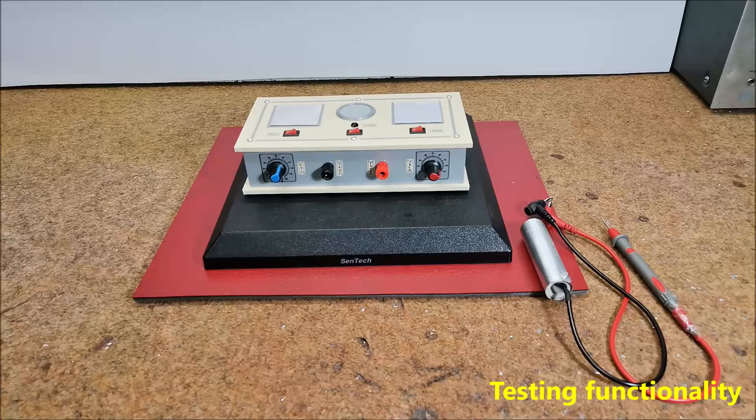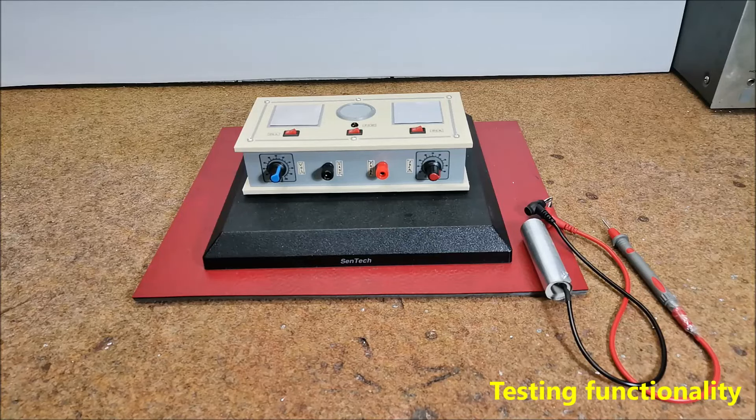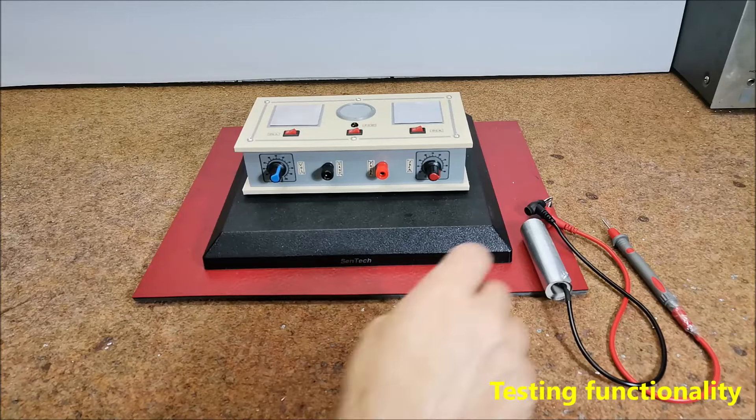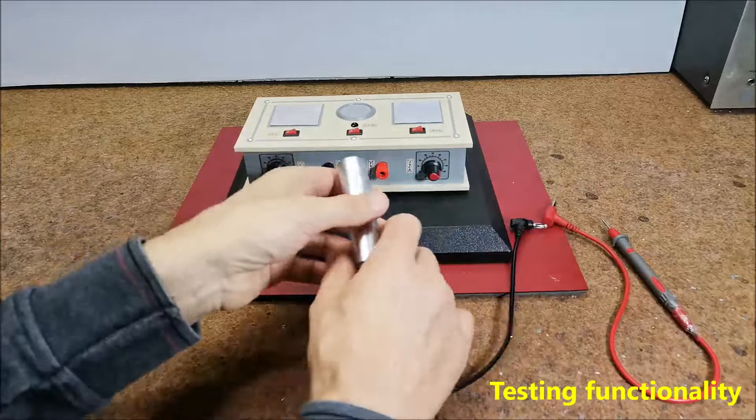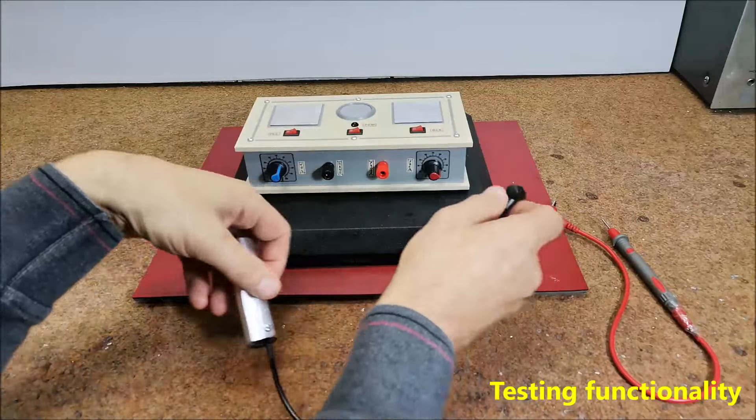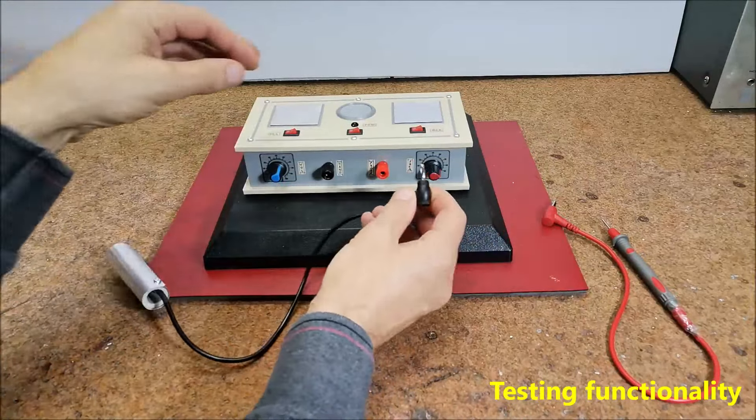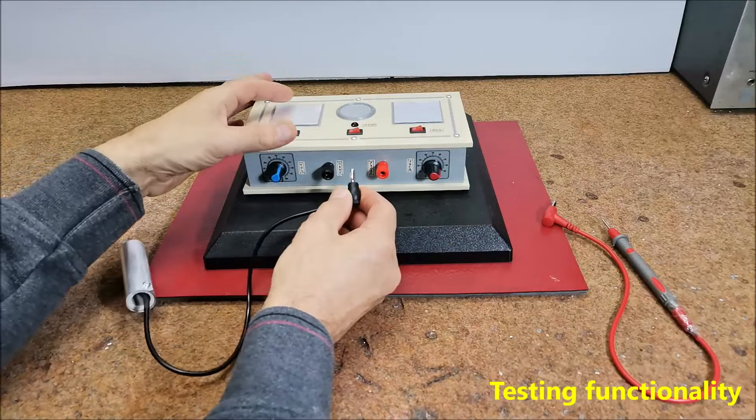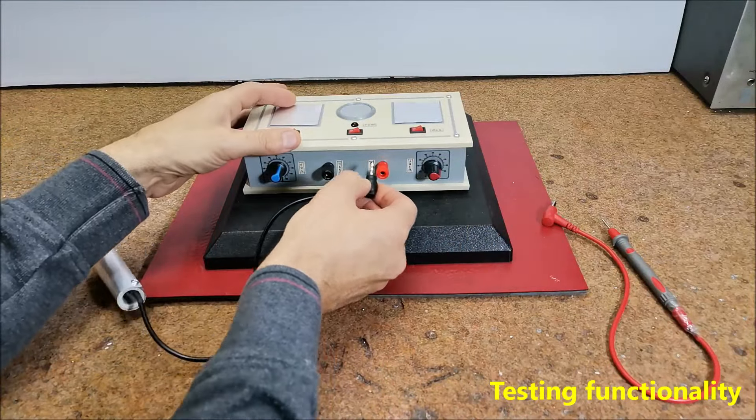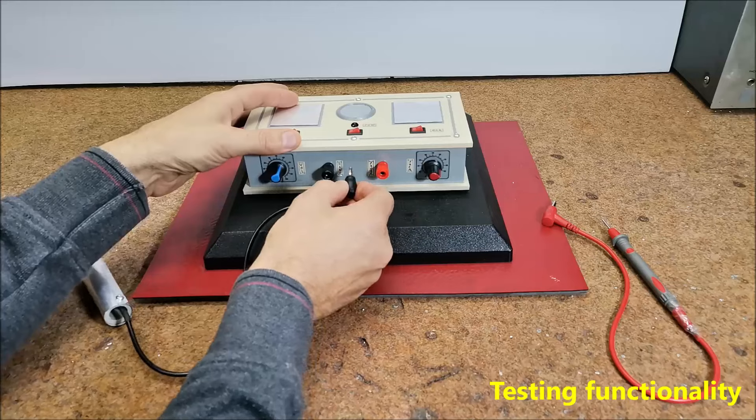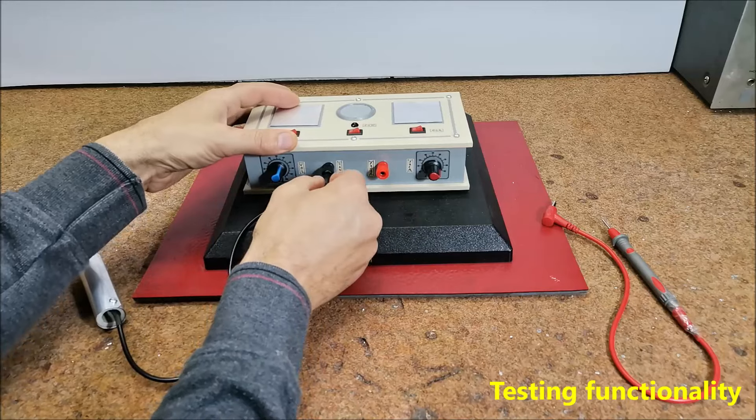Now first we need to test if the device is properly made and working. We connect the handhold and probe electrodes and turn on the syncrometer.